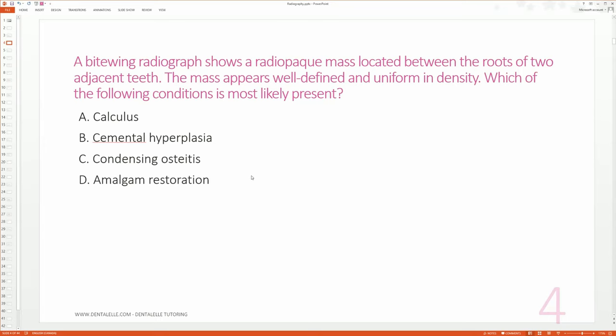Let's go through the question together. It's a bitewing, it's not a periapical this time. There's a radiopaque area, so that's a white area, but it's not just an area, it's a mass between two teeth. The mass isn't all over the place but it's very well defined. So these are very common things to know. Just off the top of my head: would calculus be seen in a bitewing? It could be. Would it be radiopaque? Think about these things.